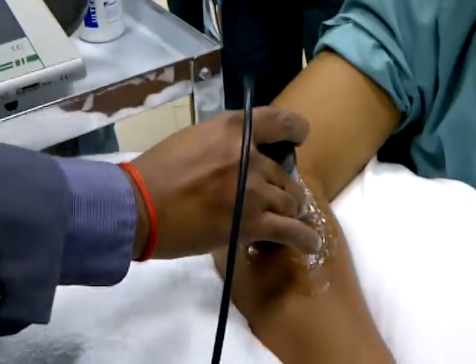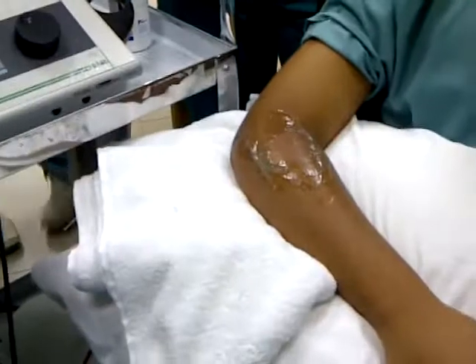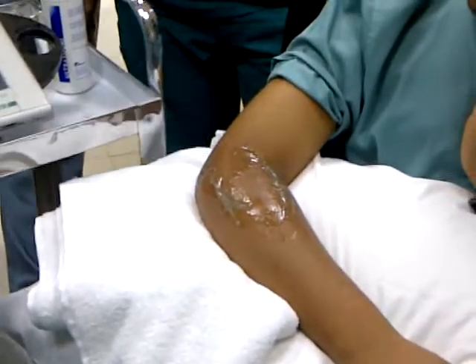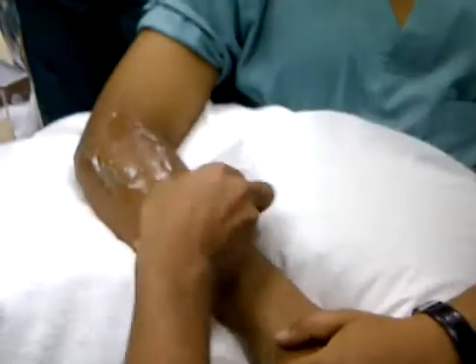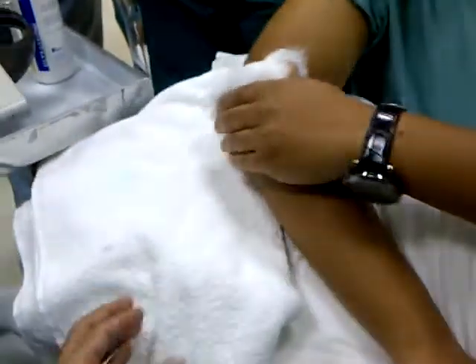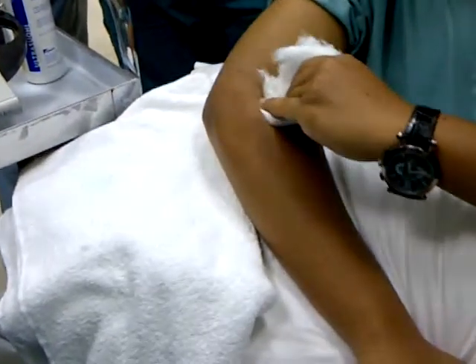So I have to do movement for two reasons. I have to produce movement, circle movement or transverse or figure of 8, the three types of strokes I told. Why? To treat all the area and prevent the burn. So to cover all the area and prevent the periosteal burn. And one more thing is the effective radiating area is smaller than the size of the head.